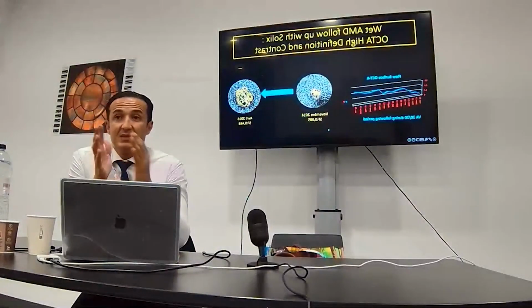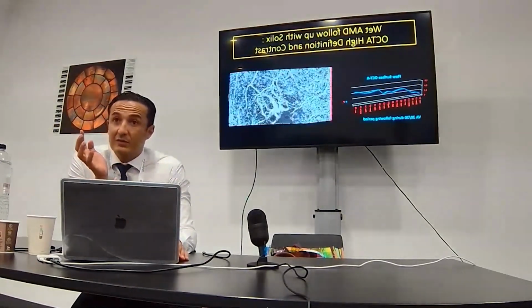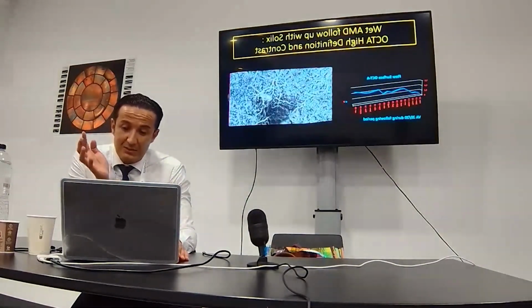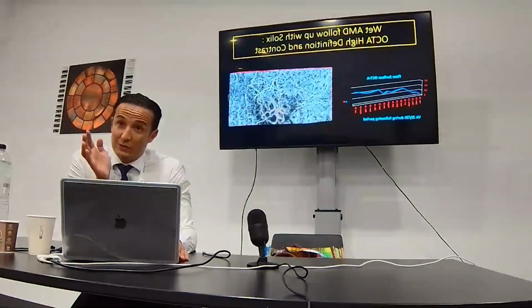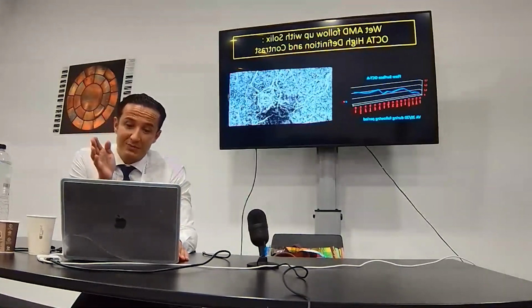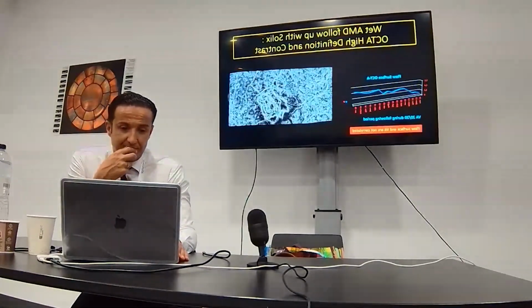And look, with this nice resolution and nice signal, you can follow the patient during 2 years, and this patient keeps the same visual acuity of 20/20, but we observe that the flow surface is not correlated with the visual acuity. And you observe maturation of the vessels.